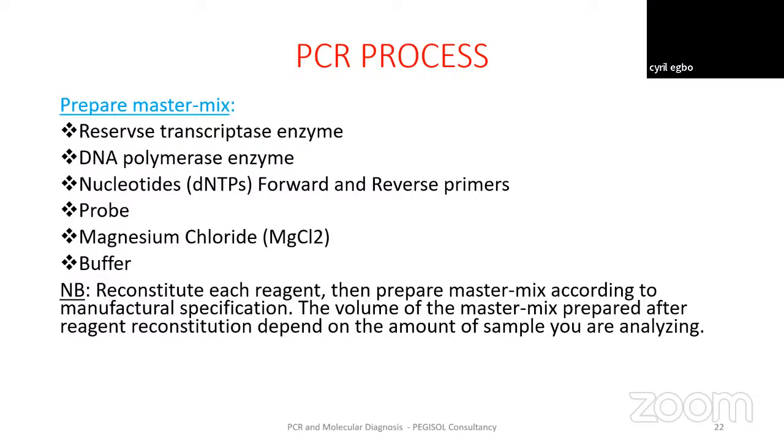Maybe the first time you did GeneXpert for that TB sample, either sputum sample, they will tell you, okay, MTB detected trace.